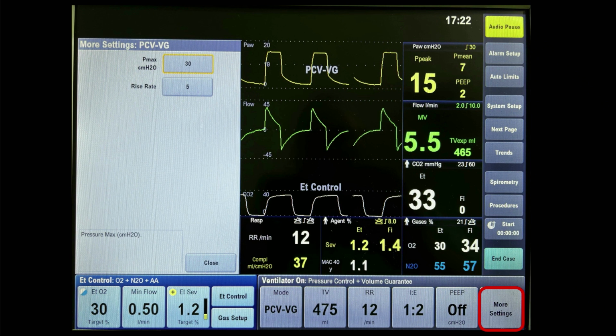And if you were paying attention, that means the pressure limit will be 25 in this ventilator. This is a fairly high number for an anesthetic case, but be warned, if you are doing a laparoscopic procedure, particularly in the Trendelenburg position, it might be quite low because of the increased pressure within the abdomen.